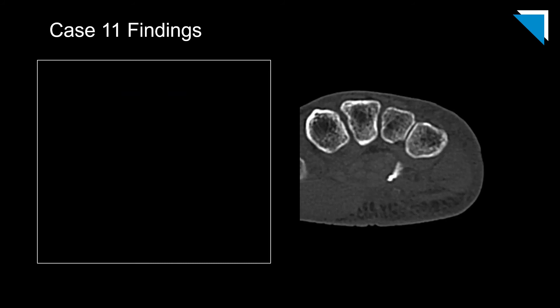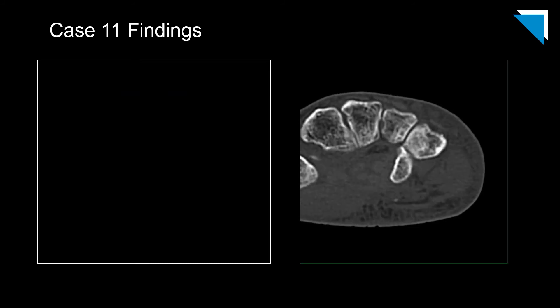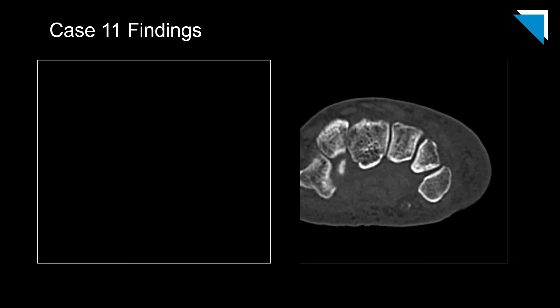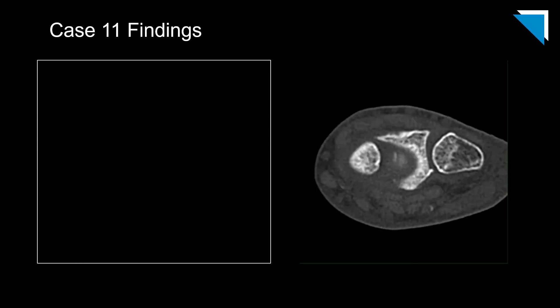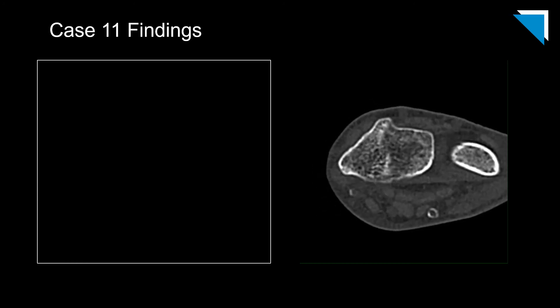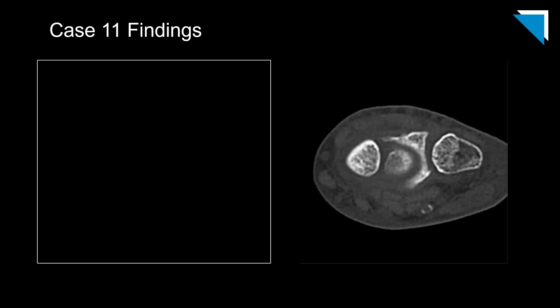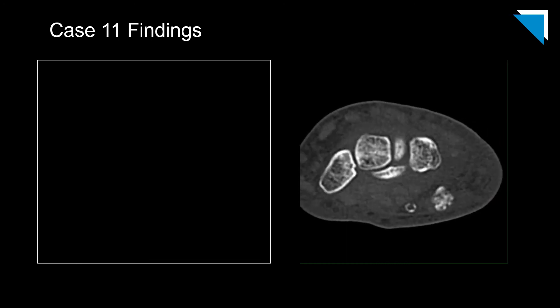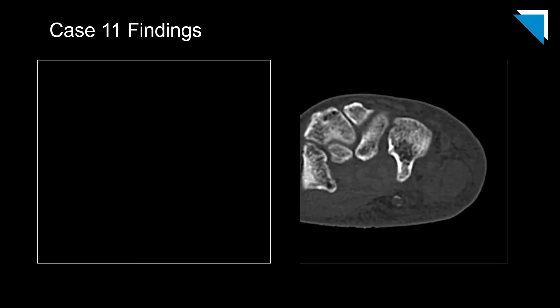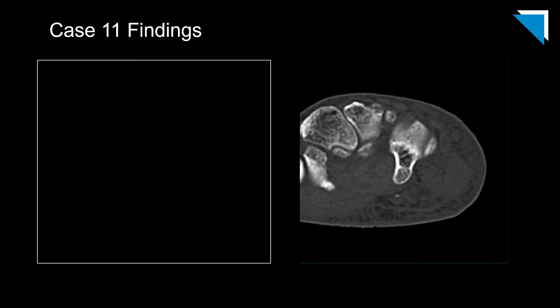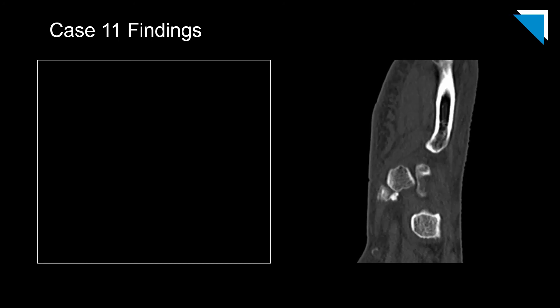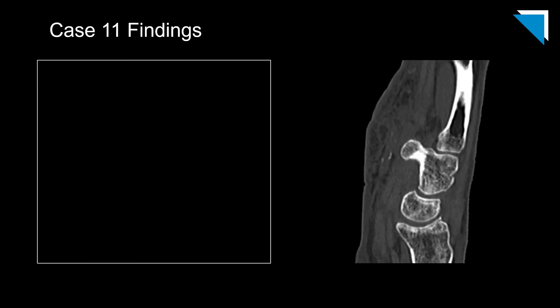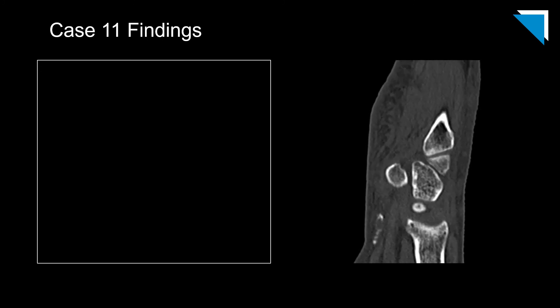As we scroll through the axial images from the follow-up CT scan, we can see that the hydroxyapatite deposition is associated with the flexor carpi ulnaris tendon fibers, which partially insert on the pisiform. The sagittal images from the same study demonstrate the anatomy very nicely — you can see the hydroxyapatite deposition in the substance of the tendon just proximal to the insertion.